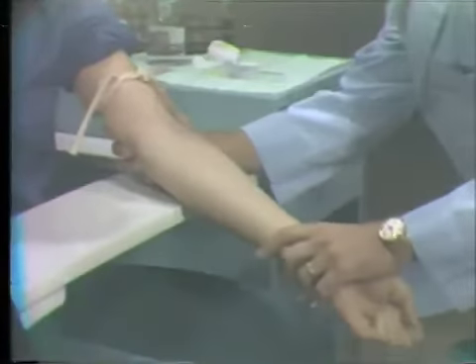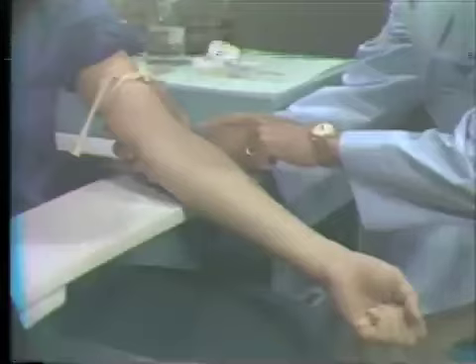This time we'll use one of the lateral vessels because it's easier to see. The vessel runs a course right along the side like this. So that means that when we do the puncture, we'll have to follow the course of the vessel. Another thing about this vessel is it's a more superficial vessel, so it has a tendency of rolling, which I think you can see it roll slightly.